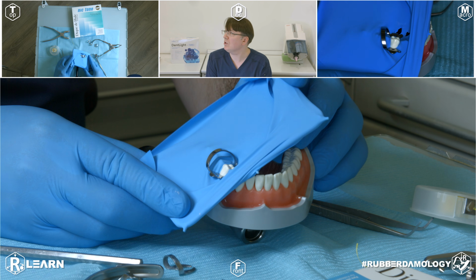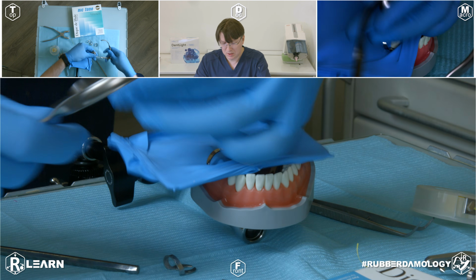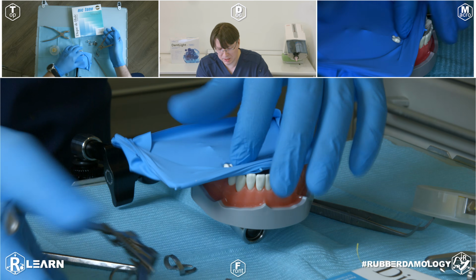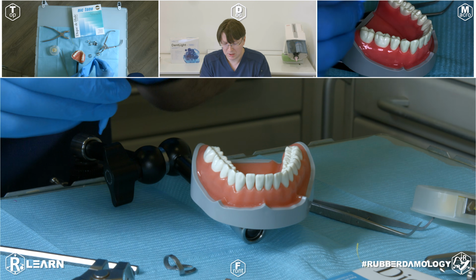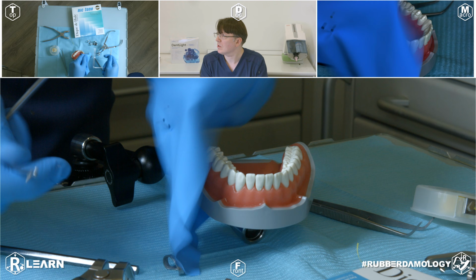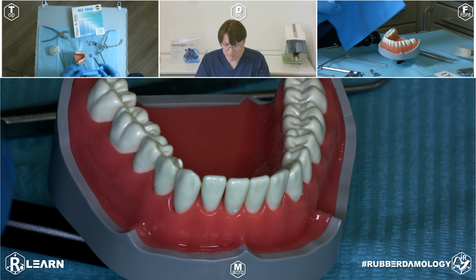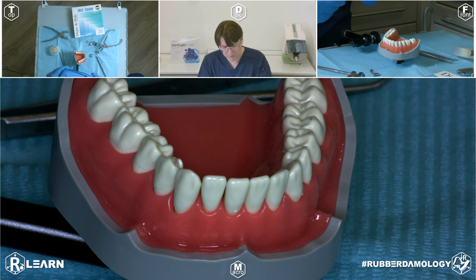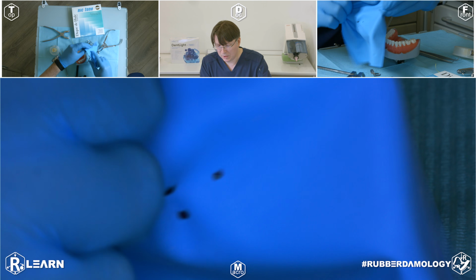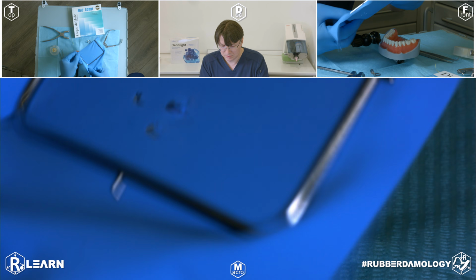So, applying rubber dam doesn't need much time. When your endodontic treatment is finished, remove your clamp, carefully remove the rubber dam and detach the rubber dam plate from the frame. Working with the butterfly clamp. Also, one inner surface for the patient, the working surface for you, fix the rubber dam plate.